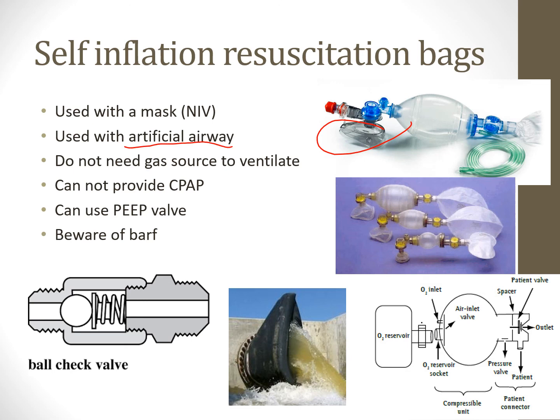Right after we intubate, you just take off the mask, and there's a 22 millimeter adapter there, and you just bag the patient. The 22 fits on the 15, which is the endotracheal tube, and then you ventilate that way.